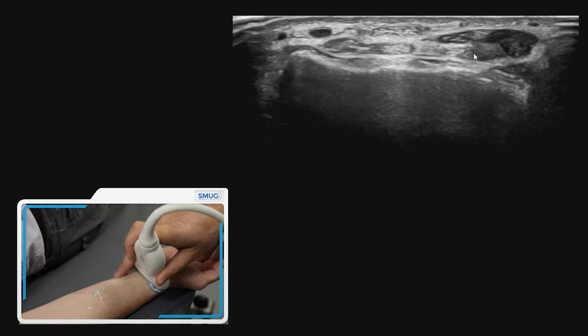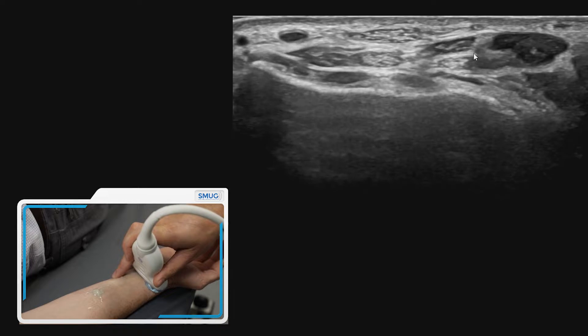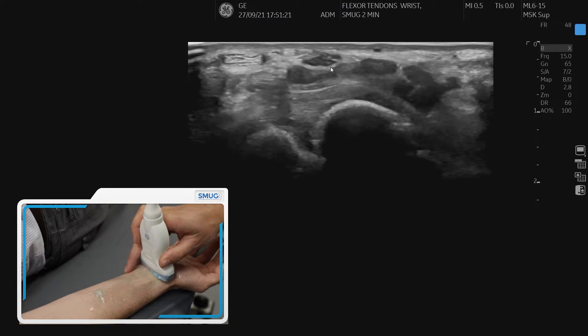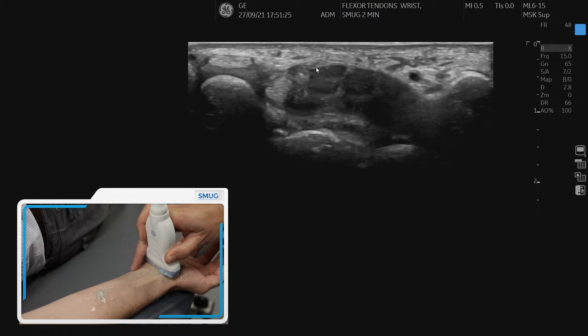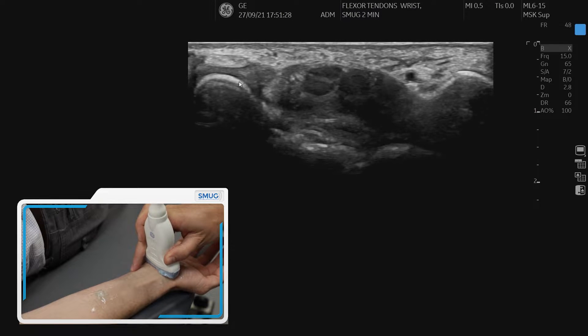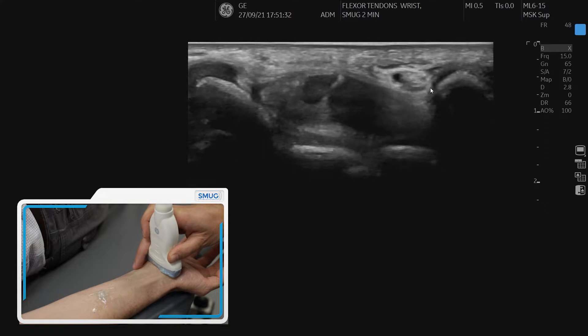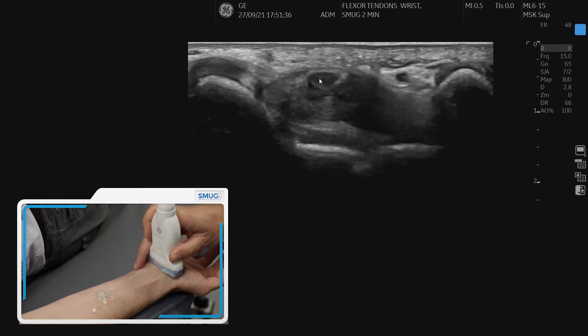Tilting the probe — because these structures are quite prone to anisotropy — we can follow the median nerve down. Keeping an eye on that nerve and tilting the probe, we can see the flexor retinaculum over the top. We are then looking for the scaphoid on the radial side and the pisiform on the ulnar side.